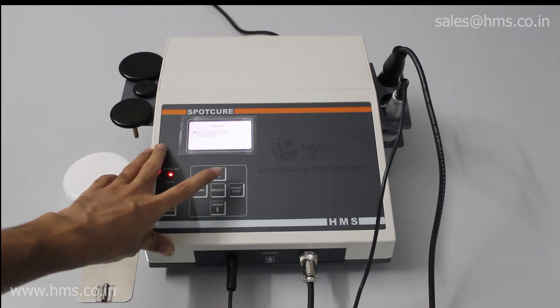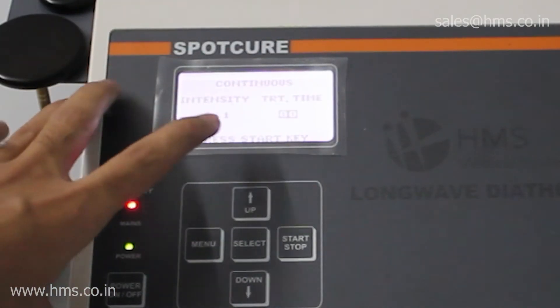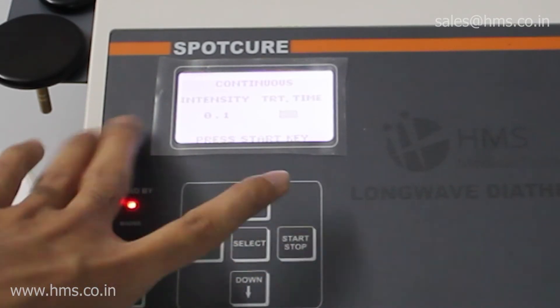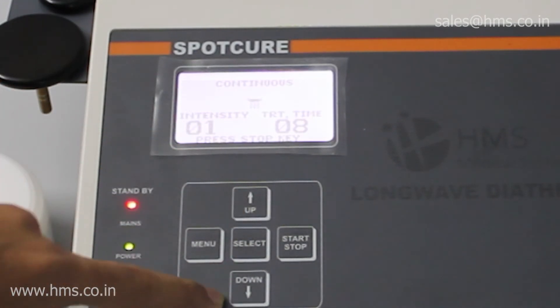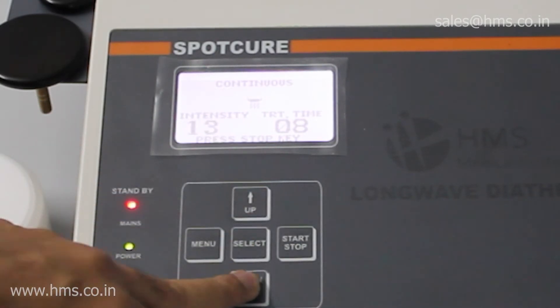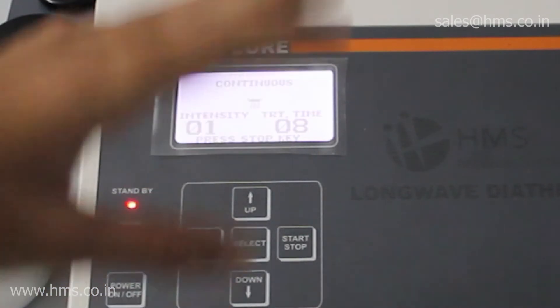In continuous mode, you have a treatment time setting option and an intensity level setting option. You just set the treatment time and press the start/stop button to begin the treatment. You can vary the intensity using the up and down arrow keys — pressing up increases the intensity and pressing down decreases it.